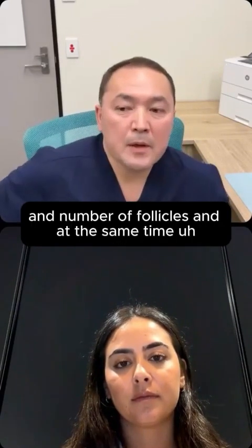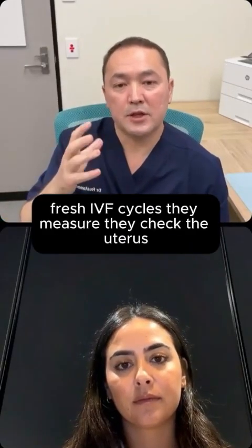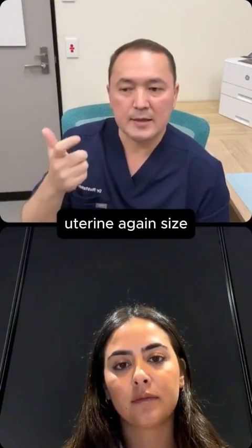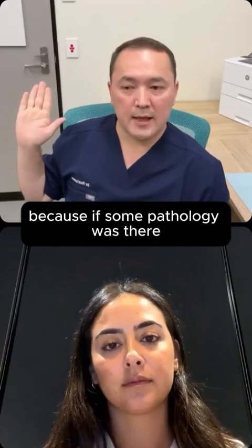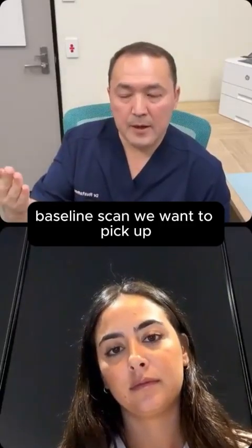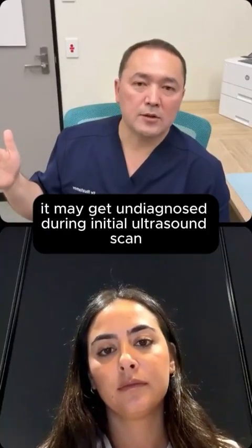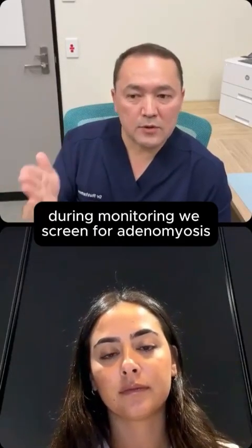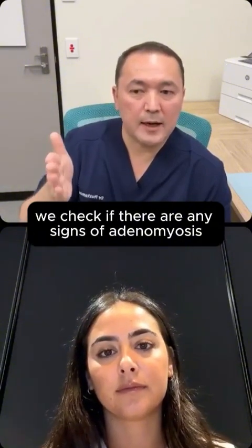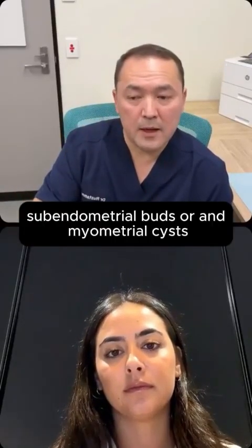And at the same time, during IVF monitoring in fresh IVF cycles, the sonographer checks the uterine size and the uterine contour, because if some pathology was there which wasn't detected in the initial fertility baseline scan, we want to pick it up. Let us say adenomyosis, for example, it may get undiagnosed during the initial ultrasound scan, so during monitoring we screen for adenomyosis. We check if there are any signs of adenomyosis, like Venetian blind sign and shadowing, subendometrial buds, or myometrial cysts.